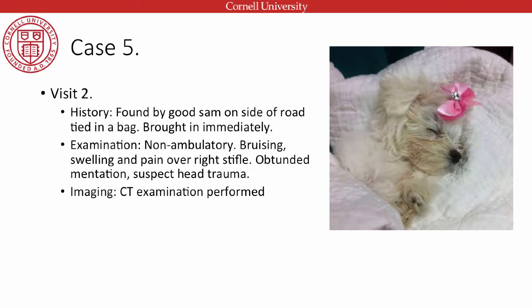They managed to make sure that this was a congruent case and it was the same dog that came in before. She was non-ambulatory, bruising, swelling over right stifle. She was also obtunded in her mentation. They suspected some head trauma.